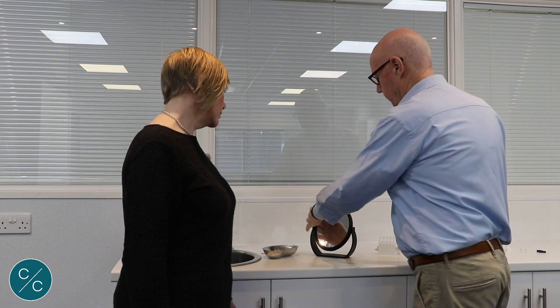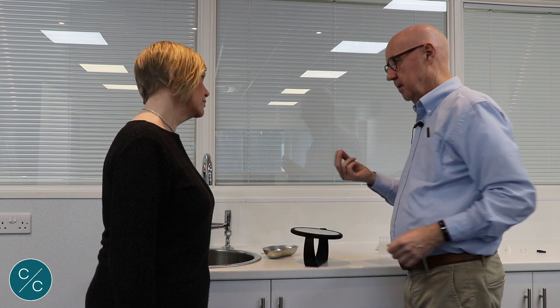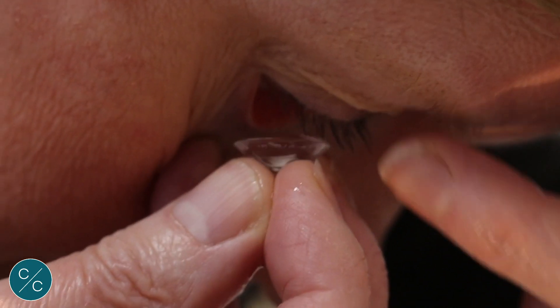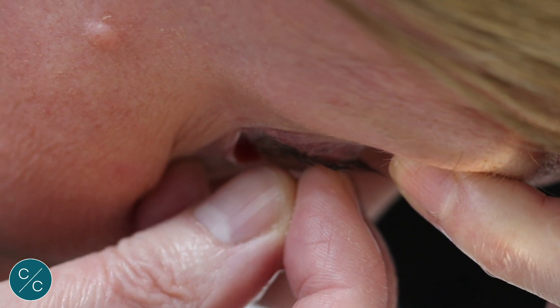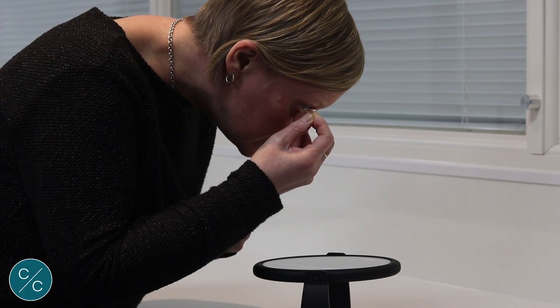We're then going to lean over, have the mirror horizontally so you can see what you're doing. This is the tricky bit — we're going to need to put this finger onto your lower lid, open wide with the other hand, and then gently raise the lens against the eye. It'll feel cold as the solution touches your cornea; just relax and gently but firmly press onto the eye. And we'll just show you that again.